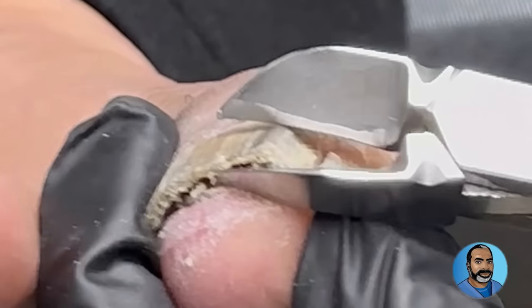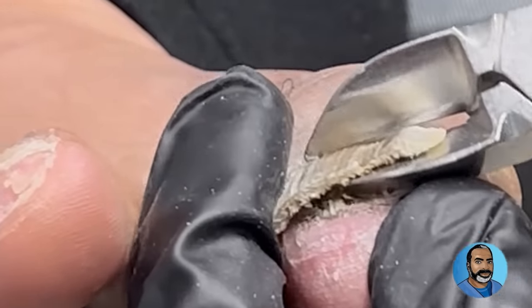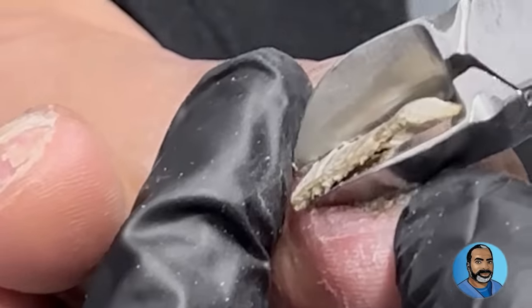The toenail was still very loose and there was still a lot of subungual debris, so I had to trim more of the nail back to expose the nail bed so I could continue to clean it up.